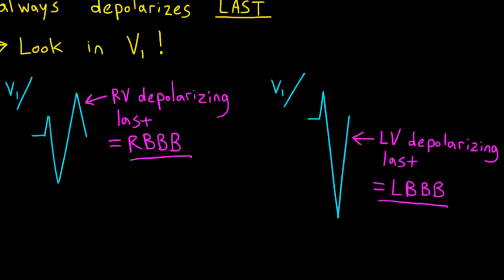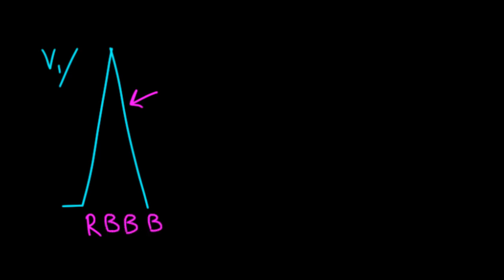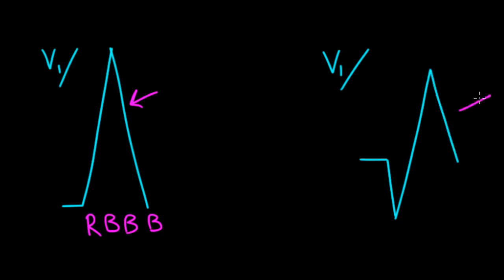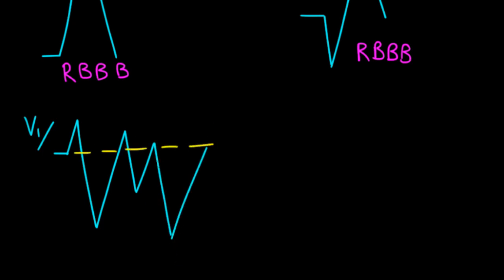Most left bundle branch blocks tend to look almost completely negative in lead V1, while most right bundle branch blocks have a rabbit ear kind of appearance. Let's look at another wide QRS in lead V1 — the whole thing is positive, including the terminal QRS, so this is a right bundle branch block. Not all right bundle branch blocks have rabbit ears, but that characteristic pattern is common. The terminal deflection determines the diagnosis.